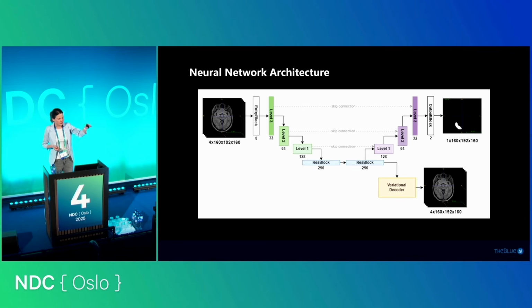In the first part of the U, we are condensing the information that we have, meaning that from the big picture, we are trying to make quite small representations, but with super many channels. And it is storing the information that the model thinks is crucial, like very condensed information about edges, shapes, etc.